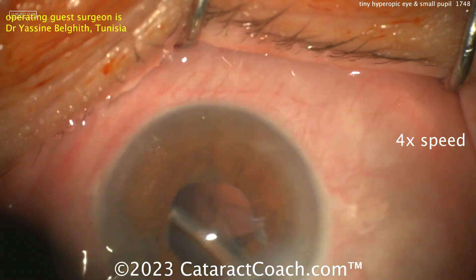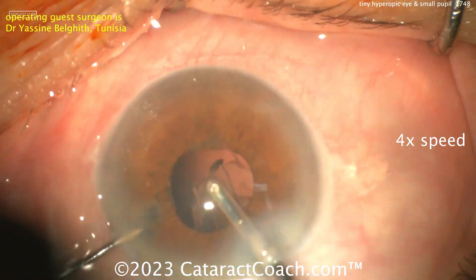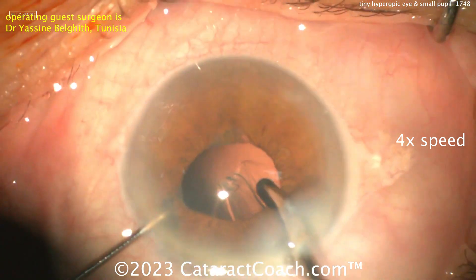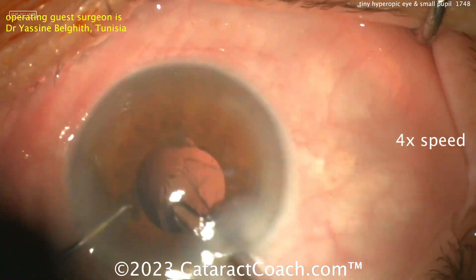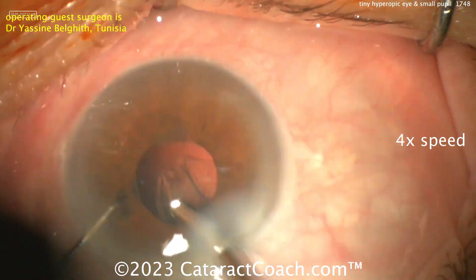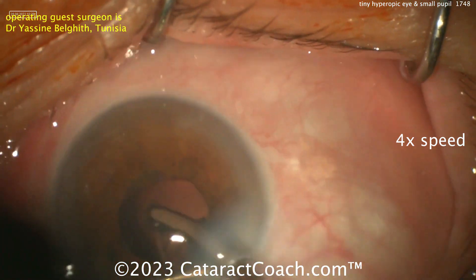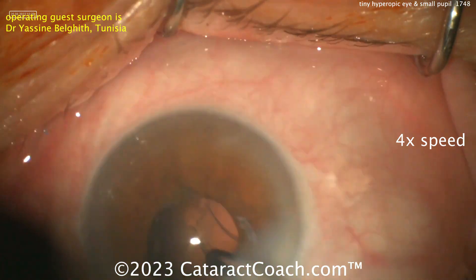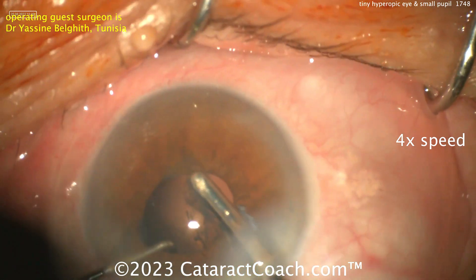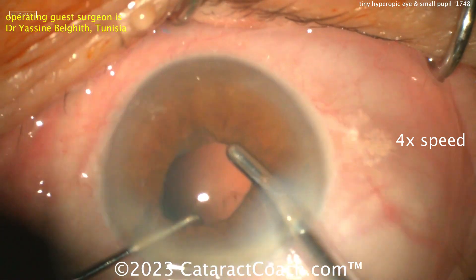Cortex removal here — looks like a bimanual or coaxial approach. You want to make sure you get all that cortex out. Use the second instrument — the chopper — to lift up the iris to make sure you're not going to leave any piece of lens material behind the iris. With poor dilation like this, that can happen. Let's talk about lens calculations — also not as accurate in these eyes.